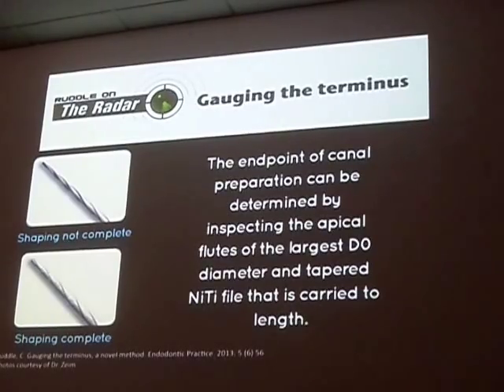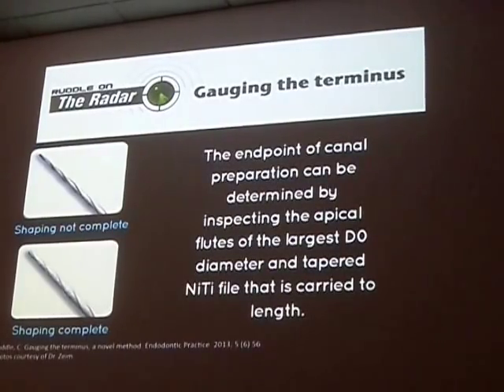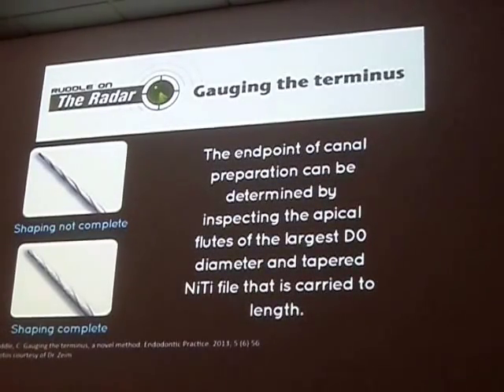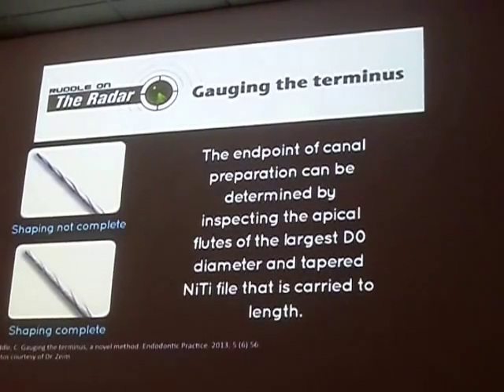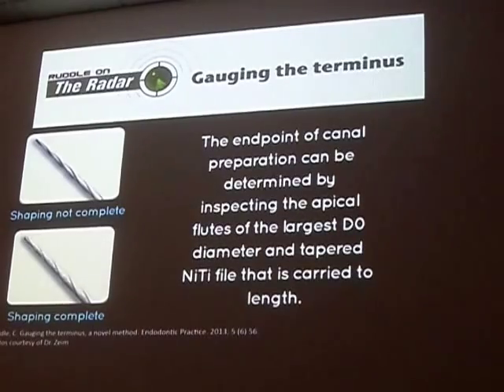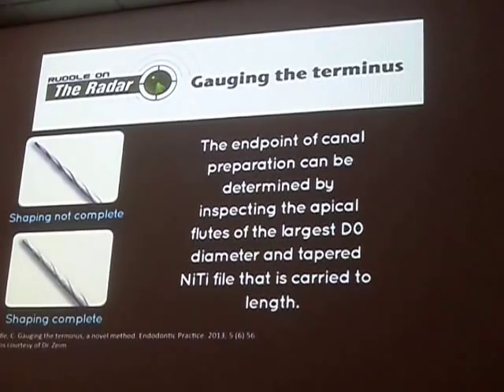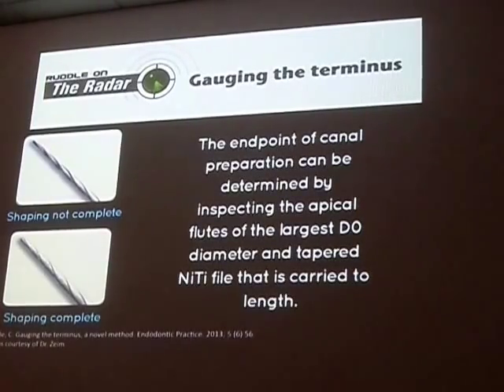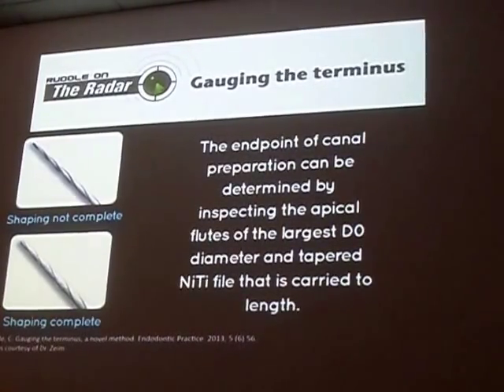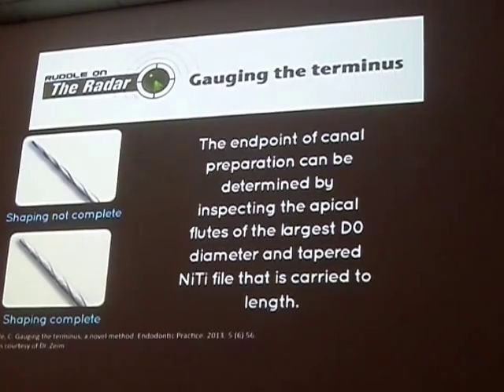En cuanto a lo que es la interpretación del polvillo dentinario, el barrido dentinario que se está quedando a nivel de las ranuras del instrumento, ¿no? En cuanto a la evaluación de cómo es este debris o cómo es este barrido dentinario de color blanco, ¿no? Para que realmente nos diga si es que estamos llegando o no al término de la preparación apical ideal. Esto en realidad es un concepto muy difícil de determinar, porque los irrigantes, ¿no? Los irrigantes van a ayudar definitivamente por su poder de bleaching blanqueador a tener este tipo de naturaleza de debris.